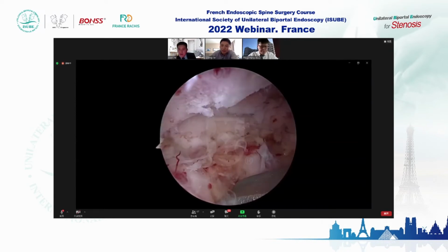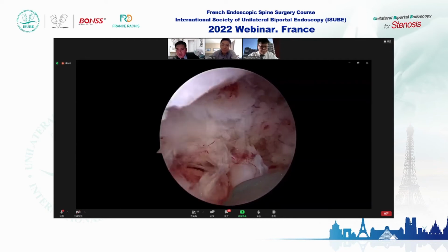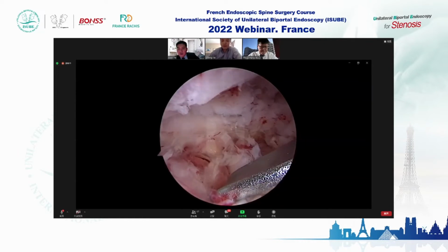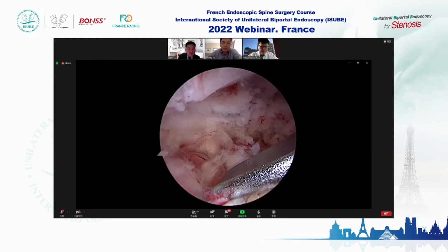So also, another from Dr. Chang. In case that the general anesthesia is not recommended, any comment with high-level lumbar anesthesia? You have some experience. Okay.